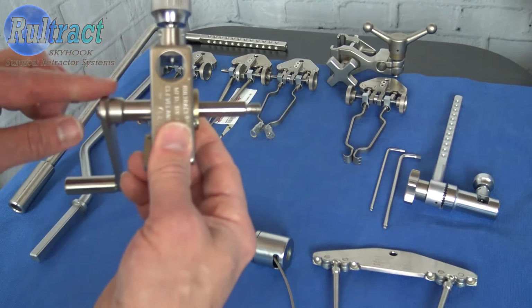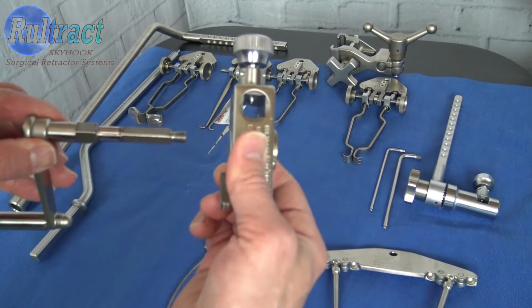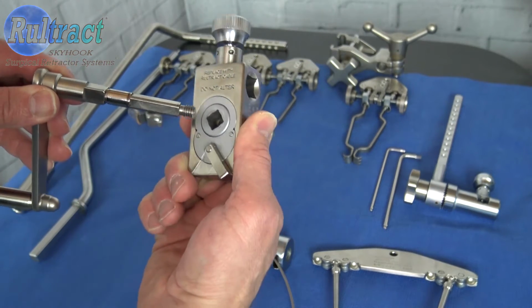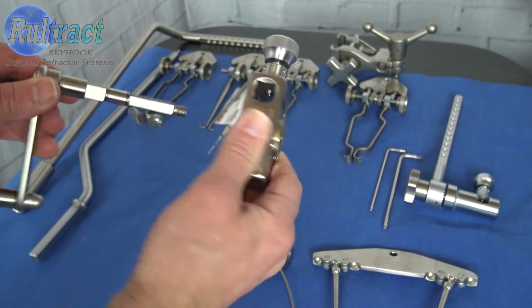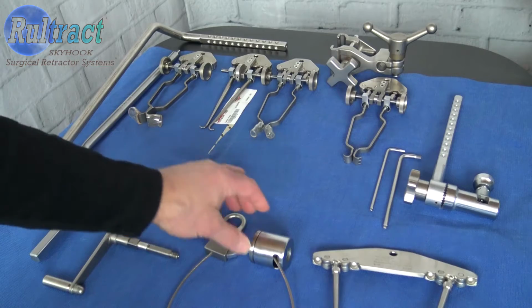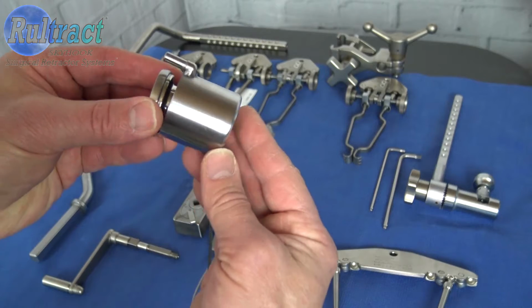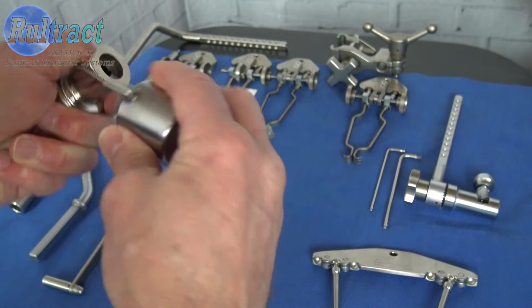Next, you're going to remove your crank handle from your gearbox, and to do that, you just simply pull it out. Now make sure that you note that you removed it from the square hole. So when you go to reassemble it, you make sure you put it into the square hole. Don't put it into the round hole. Next, you're going to separate your spool cap from your spool. And to do that, you go ahead and grab your spool and just pull the spool cap off.